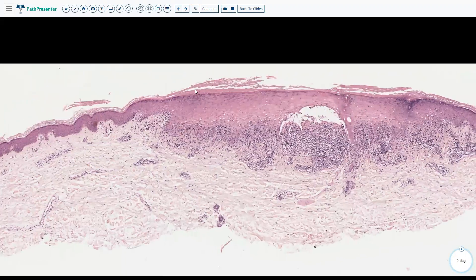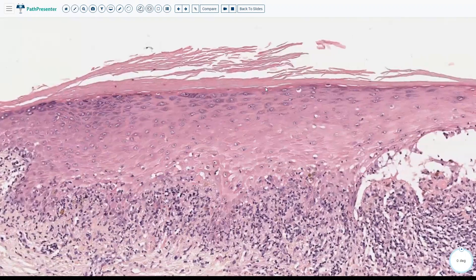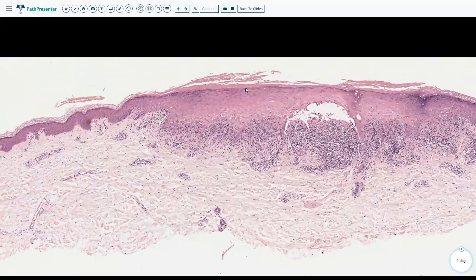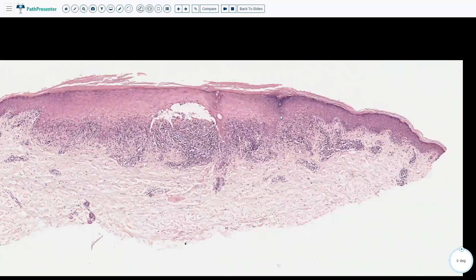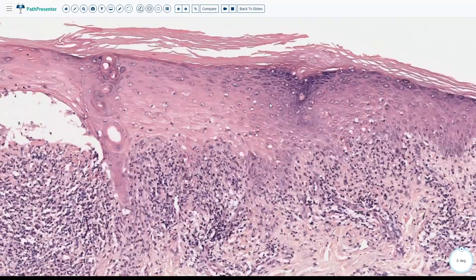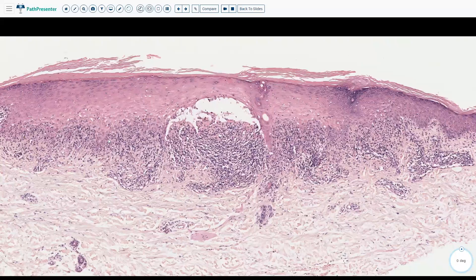Starting from the top, you see compact hyperkeratosis. Usually there is no parakeratosis, so you do not see any nuclei within the stratum corneum. There is this wedge-shaped hypergranulosis — you can see the wedge shape of the hypergranulosis here. And then very classically you see this dense lichenoid infiltrate at the dermal-epidermal junction. For the definition of a lichenoid reaction pattern, you need this infiltrate to be hugging the dermal-epidermal junction. In a superficial perivascular infiltrate that is dense, you are going to see some sort of a space between the dermal-epidermal junction and the inflammation.